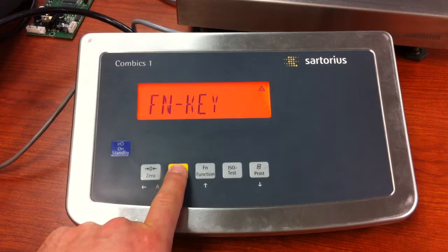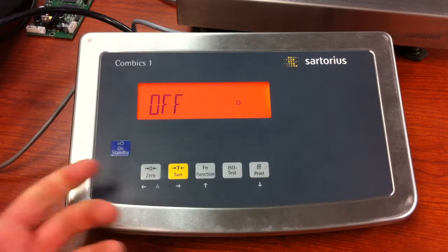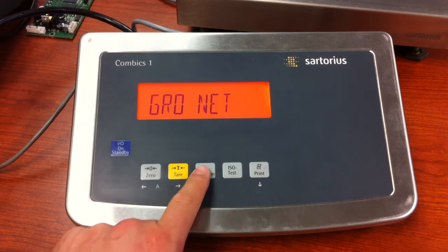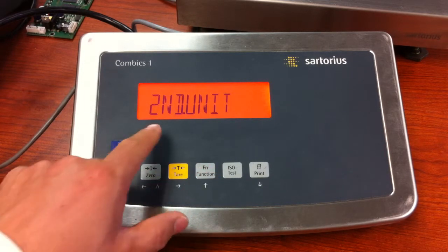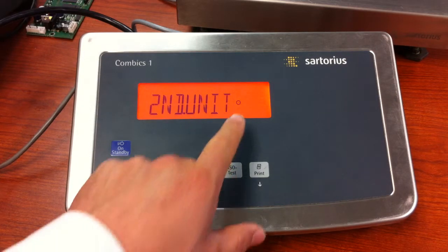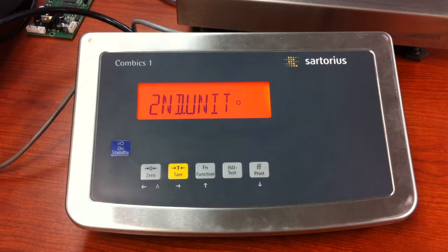Now press and release the tear key. Right now it's not set up, so we want to set it up. Press and release the function key until you see second unit. Press and release the tear key. You get a little circle telling you that that is confirmed.